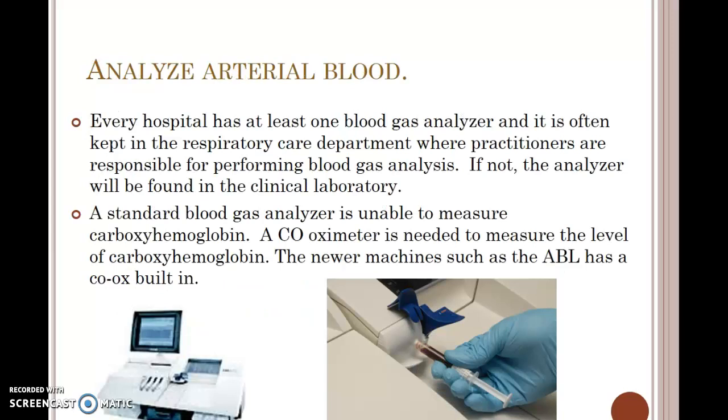Analyzing the arterial blood gas, every hospital has at least one blood gas analyzer, and it's often kept in the respiratory care department where practitioners are responsible for performing blood gas analysis. If not, the analyzer then will be found in the clinical laboratory.